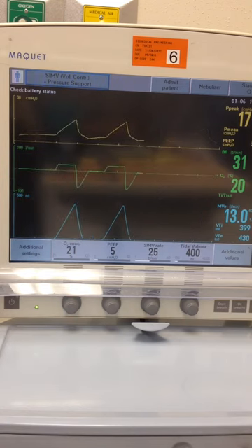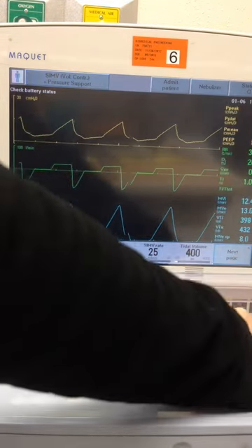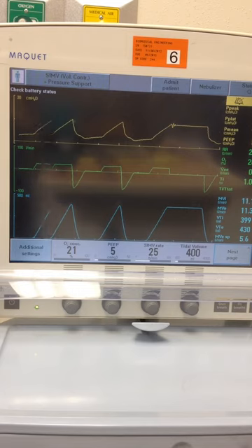Our peak pressure is 17. Let's see what our plateau pressure is — 16. So just one point difference between the two.